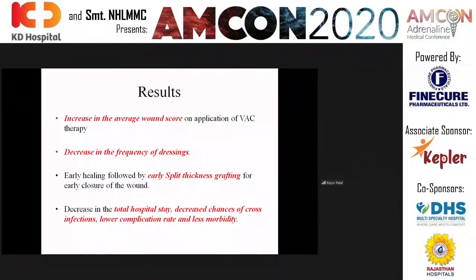Results: there is an increase in the average wound score of the wound on the application of VAC therapy. There is a decrease in the frequency of dressing change, and early split thickness grafting enables early closure of the wound and decrease in hospital stay. Next.